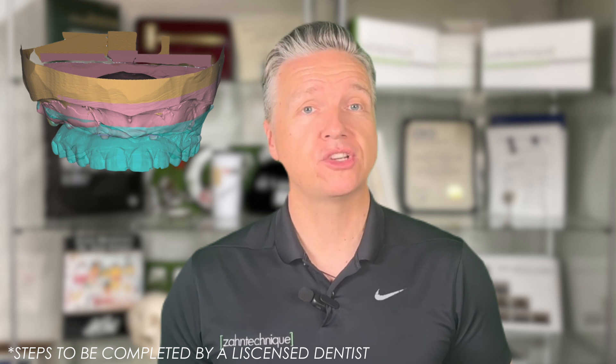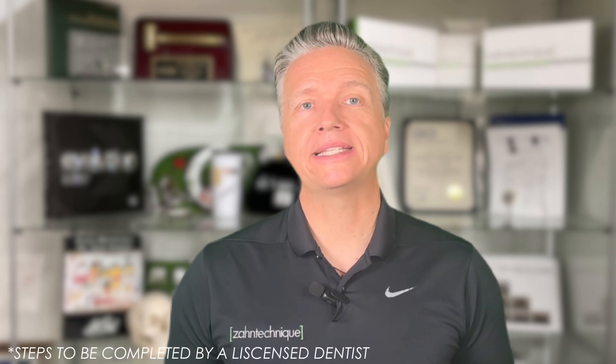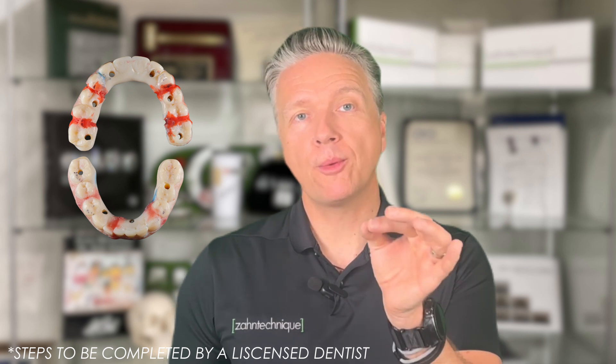After converting the immediate provisional — either on the same day or the next day as a delayed loading — we take a scan of the adjusted provisional. After three months of healing, we can deliver a prototype and verification check as one piece to the first appointment post-surgery. The prototype delivered after three months is used to verify implant position and accuracy of scans versus printed model, and for confirmation of occlusion and aesthetics. If you do find a non-passivity, all you need to do is segment the prototype and re-lute it with pattern resin.